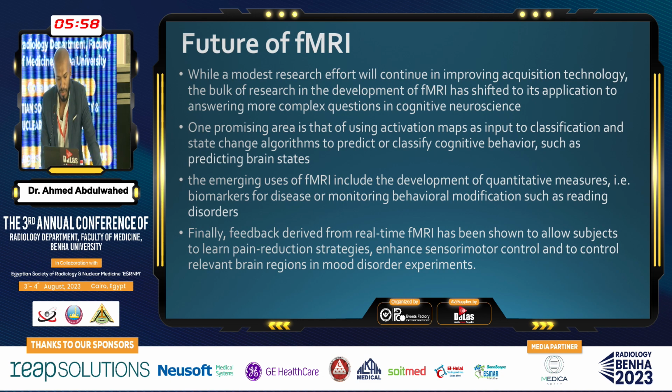The emerging uses of fMRI include the development of quantitative measures as biomarkers for diseases. Finally, the feedback from real-time fMRI has been shown to allow subjects to learn pain reduction strategies, enhance sensory motor control, and control relevant brain regions in a mood disorders experiment. Thank you.